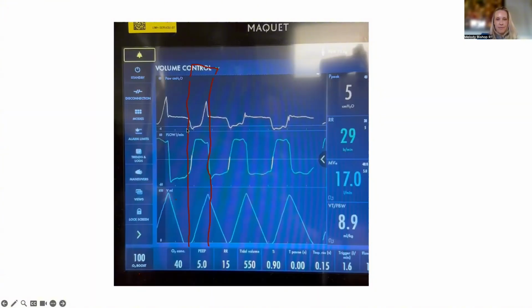about this more because this is probably more of a ventilator, how it actually works type deal. And correct me if I'm wrong, but in volume control, there's a certain amount of flow and pressure, literally in the tubing, right? So the patient pulls down so hard they can pull all that flow and subsequently all that pressure in the tubing out, and this is what you get.